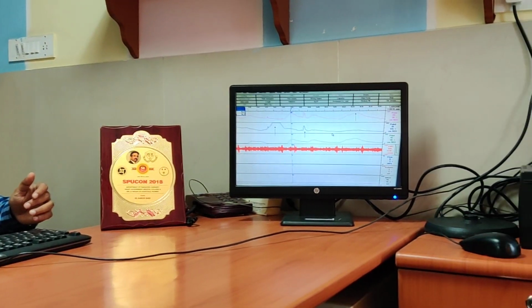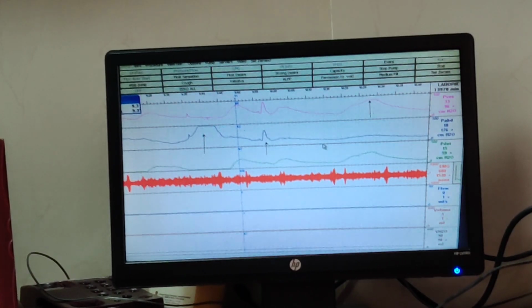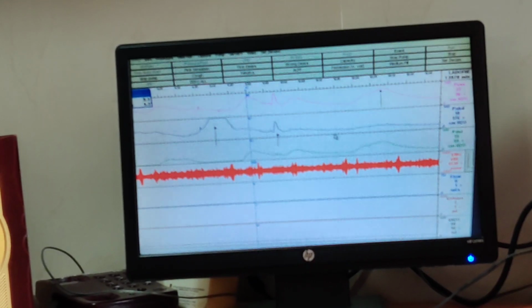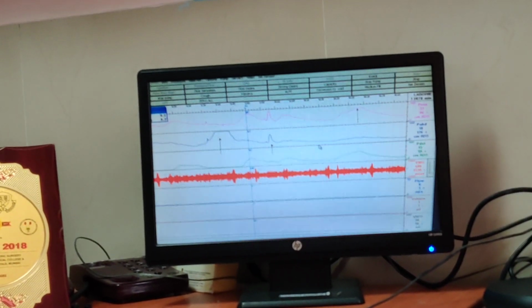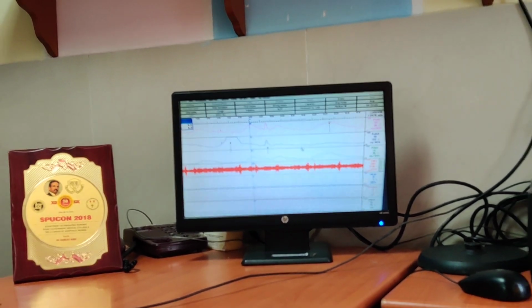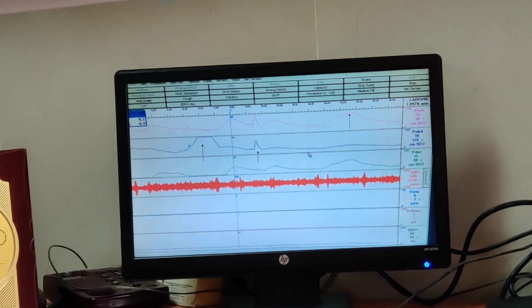When there is a smooth increase in abdominal pressure, we know that it can be because of a rectal contraction. So these are some of the things, and here you can see the first deflection shows only a movement in the second line, which is a rectal line. So that's a rectal contraction causing a negative deflection in the P det. The second arrow marks a cough, which is an acute wave. That is reflected in the first curve, which is P vesicle, and second curve P abdominal, but that is subtracted nicely, and that is not seen in the P detrusor.